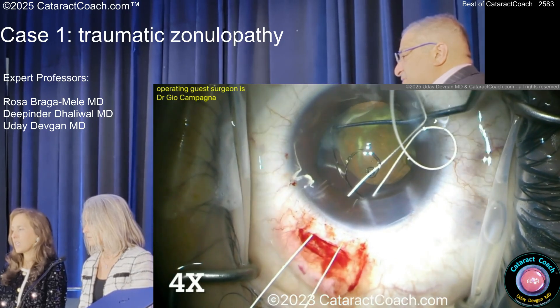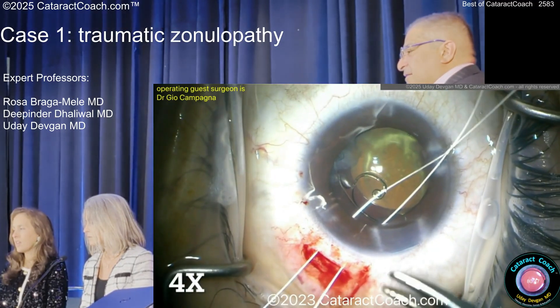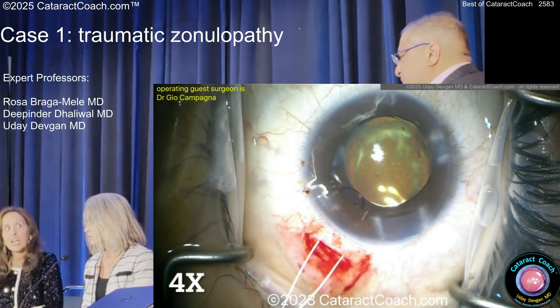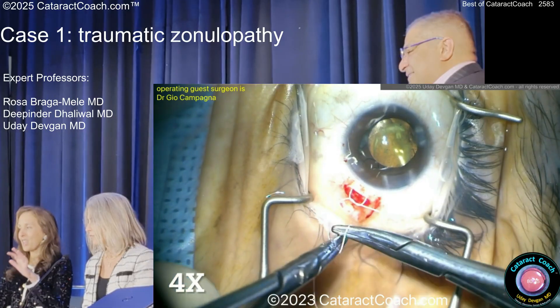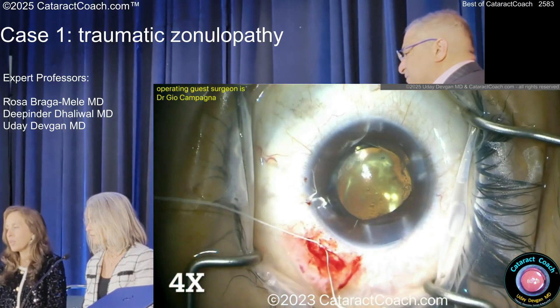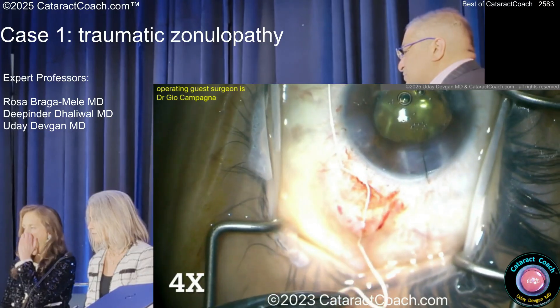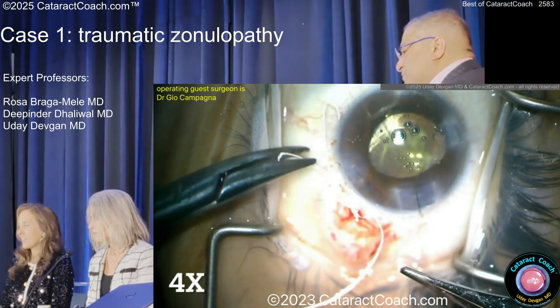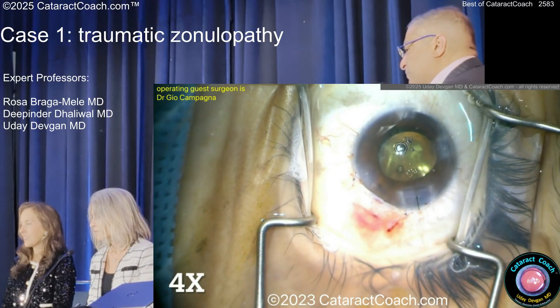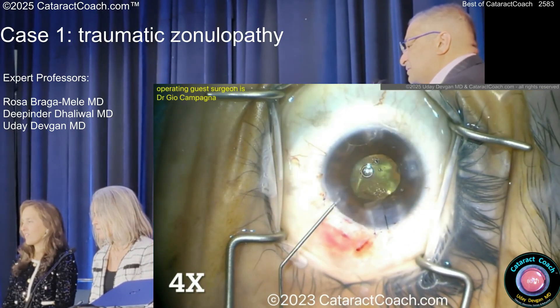I think the Gore-Tex is certainly going to last the patient's lifetime — obviously this is an off-label use. Pull that through and tighten it up nicely. How tight do you want to pull this? It should just be like the zonule kind of hanging there, so don't pull it too tight. You want it to center up the lens. And then make sure you bury the knot — key point: you don't want the knot sitting there under the conjunctiva, it's going to be too much of an erosion point. So rotate that, get the knot buried within the eye. I like that a little half-scleral depth groove was made — now you can bury or have the band of Gore-Tex fall in that groove. I also like the suturing of the 10-0 nylon of the main incision, probably a good idea in a case like this.